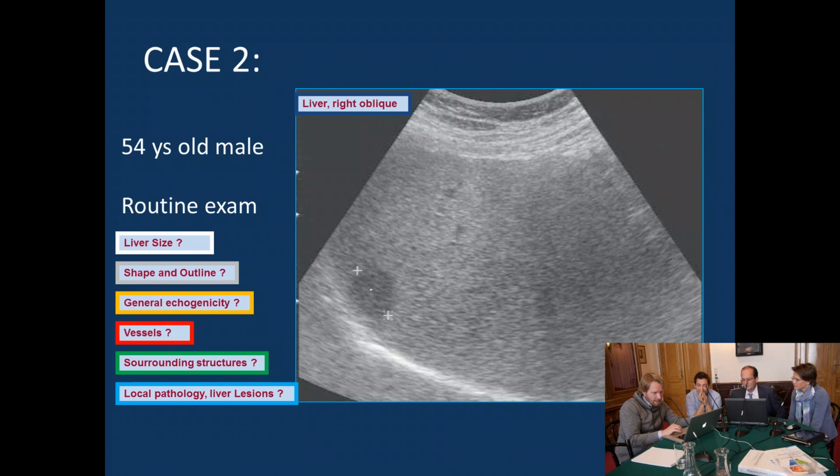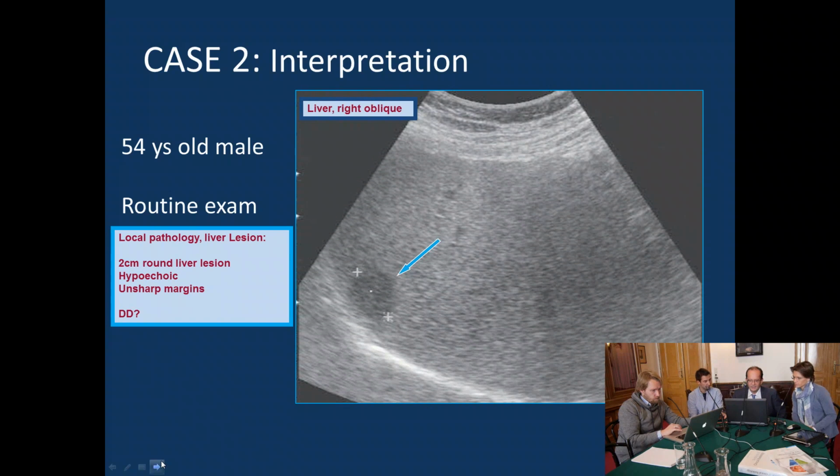Well, this is difficult, of course. But a sharp lesion would delineate a little bit better. It is slightly inhomogeneous, I would say, but the description was quite good. So let us have an idea about what that is.